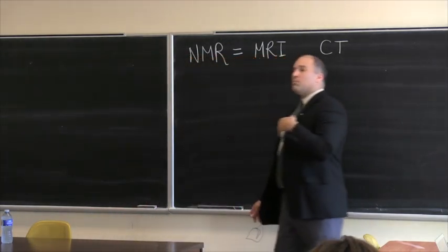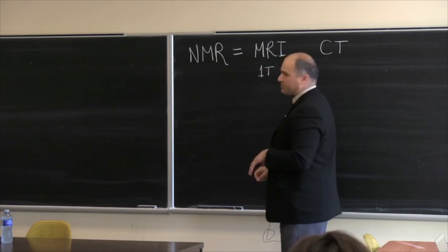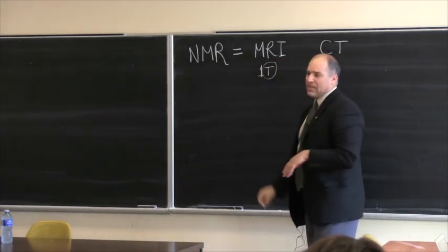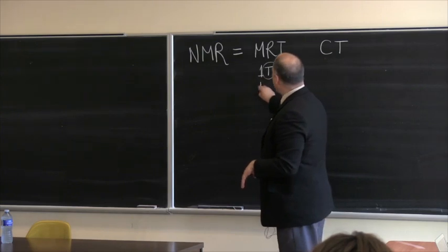And for a number of years, the standard for using MRIs started at around 1 Tesla. We usually measure MRIs in a unit of field that is called a Tesla. It has to do with the strength of the magnetic flux. We're not going to go into it. So it started at 1. It went up to 1.5, which became the standard.